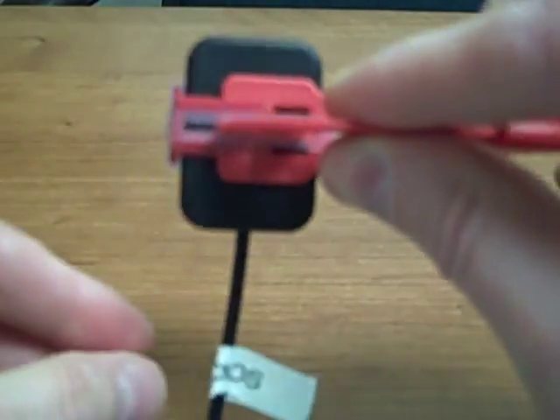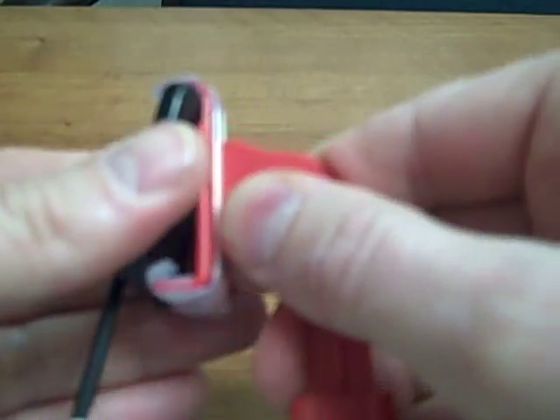There's a bite block for each indication. Here you can see this is the vertical bite wing bite block, and this would be a horizontal bite wing.